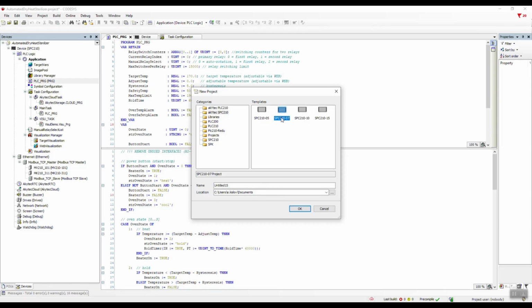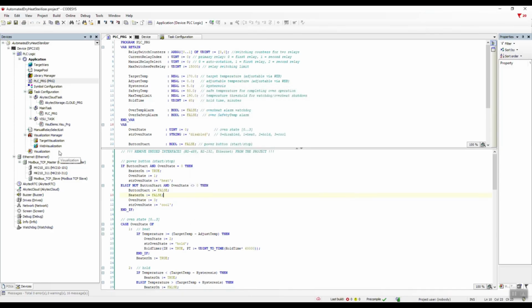If we draw an analogy with other manufacturers, usually you would have to create a standard project and manually enter some typical settings each time. But with akYtec, this process is much simpler and you just need to select the required equipment modification. For example, these project templates already include visualization by default. With the correct screen resolution, some commonly used system libraries are already added, and, for example, global variables are linked to the nodes of the project tree.